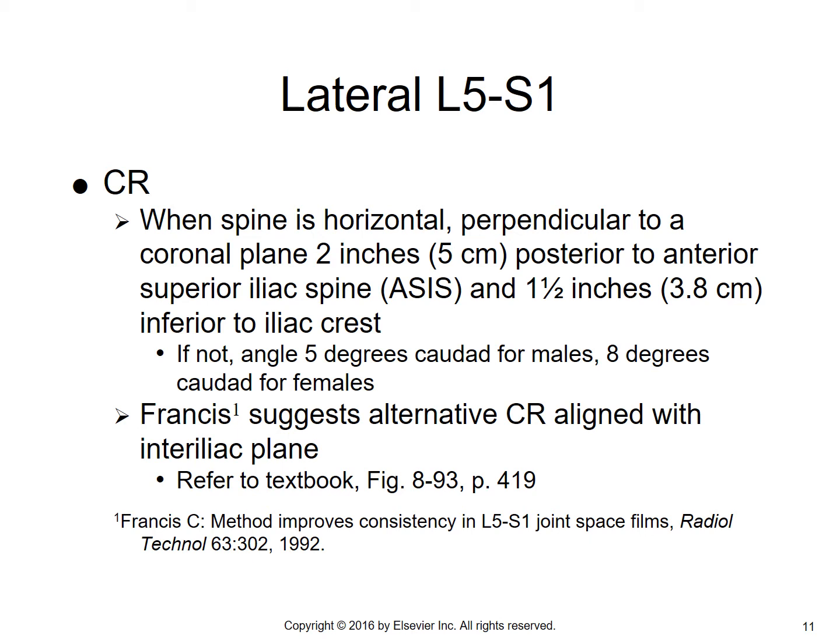If the spine isn't horizontal, you're going to angle 5 degrees for males, 8 degrees caudal for females. So that's very important to remember. You often see questions about this on exams, review books, on the registry. 5-degree caudal for males, 8-degree caudal for females.